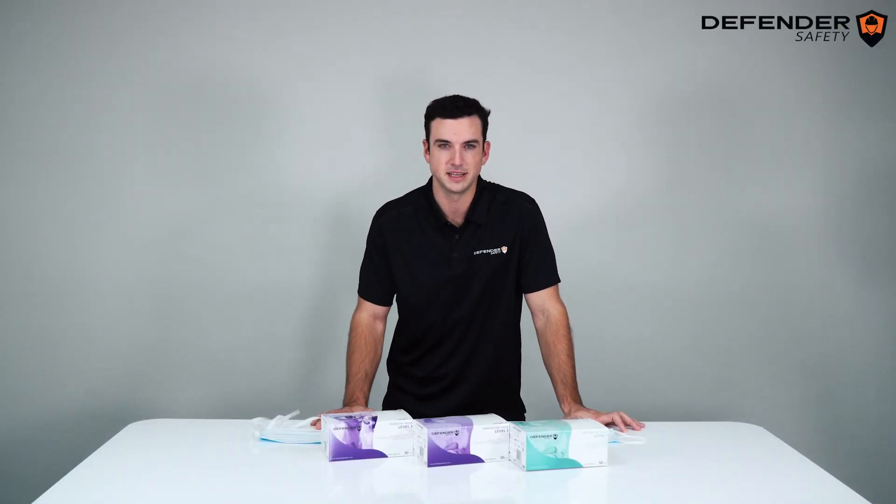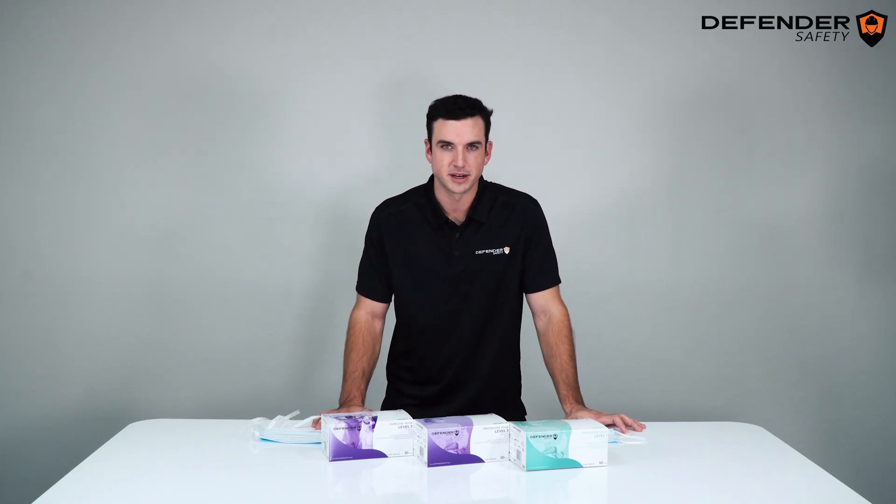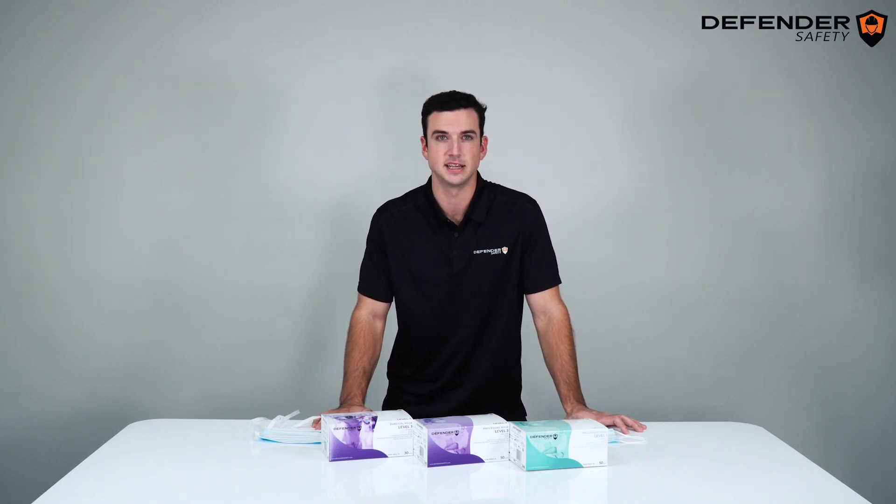I'm Tom Lemons with Defender Safety, and I'm here to give an overview of our procedure and surgical masks. Before I take you through these products, I want to discuss the issues we saw with the foreign-branded PPE that flooded the market in the current COVID-19 pandemic.